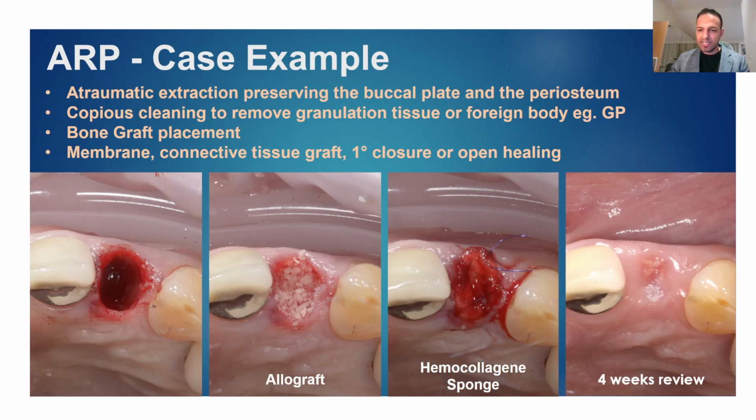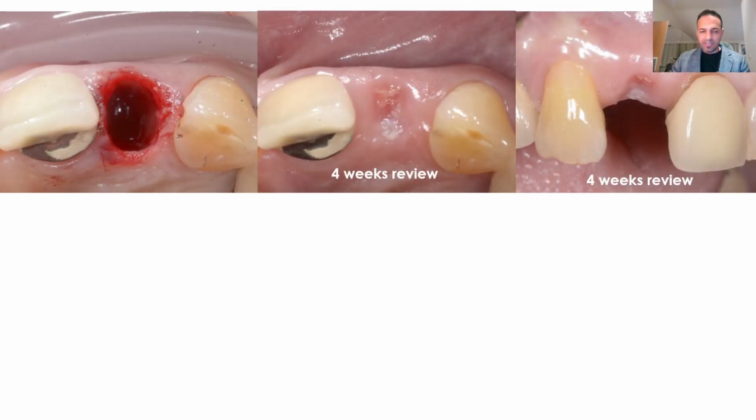a little bit of the allograft is sort of showing its head through there, and beautiful healing. As you can see, the buccal plate, if we sort of draw a line there, the buccal plate has been preserved throughout, and it's still out there. That definitely wouldn't be the case if you didn't graft the area at 4 weeks.